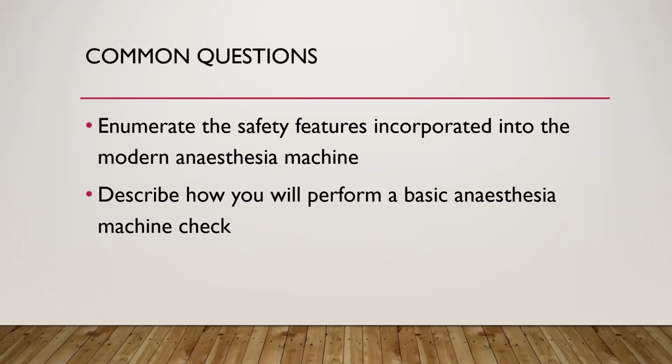Anti-hypoxic guard. Yes, I agree with you, but that is too vague. What are those anti-hypoxic devices in the anesthetic machine? Break it down. Oxygen is located downstream, yes, to prevent a hypoxic gas mixture. I agree. Up regulation of nitrous oxide is tied to oxygen, so that you cannot increase the nitrous oxide without a concomitant rise in oxygen. Beautiful. What is that system called? If you get it, I will buy you lunch tomorrow.